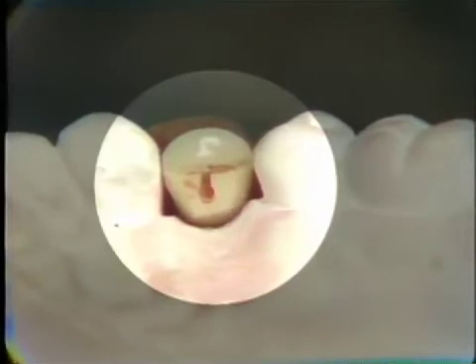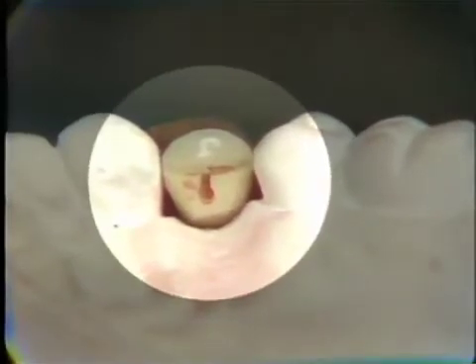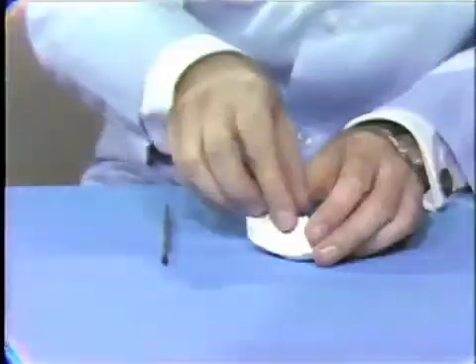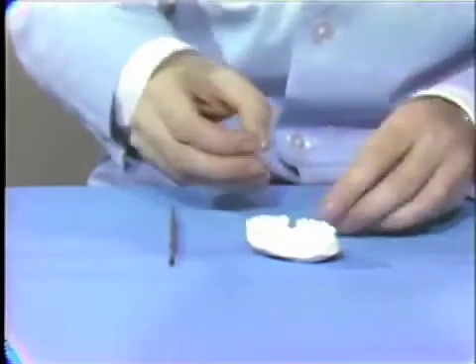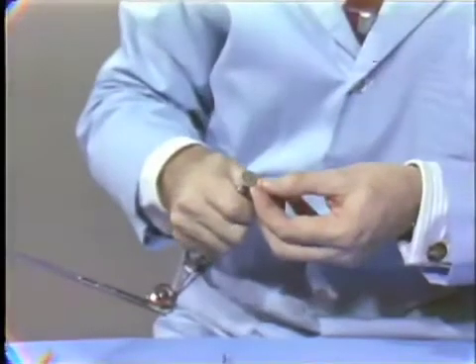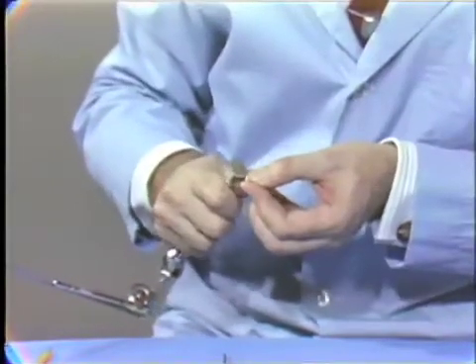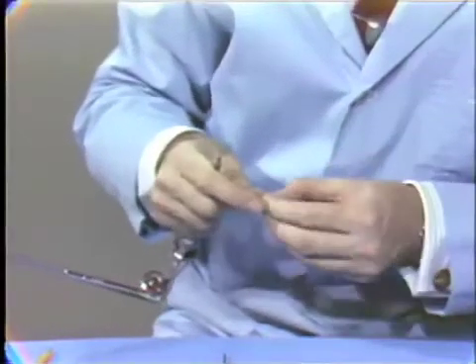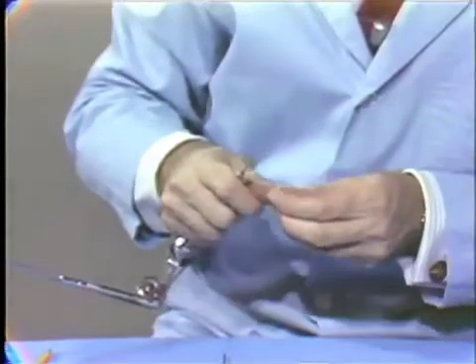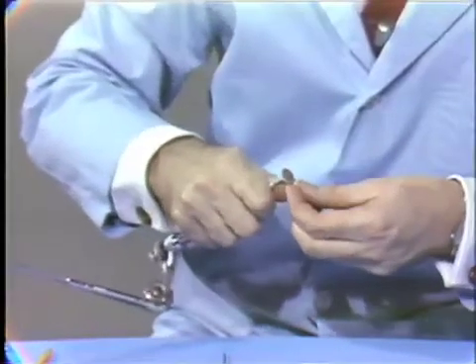You remember the ridge lap touches the mucosa on the buccal up to the crest of the alveolus and then sweeps away and clears that. So the next thing I'm going to do is just to round off those areas in there. Using again the same type of stone. What you have to be careful in doing this particular adaptation, of course, is its relationship to that slot running through the porcelain where the metal backing is attached.